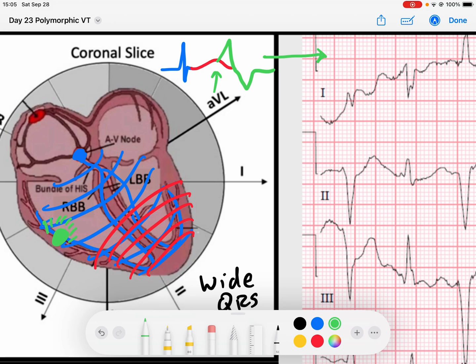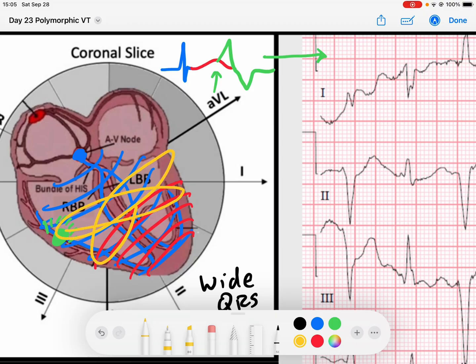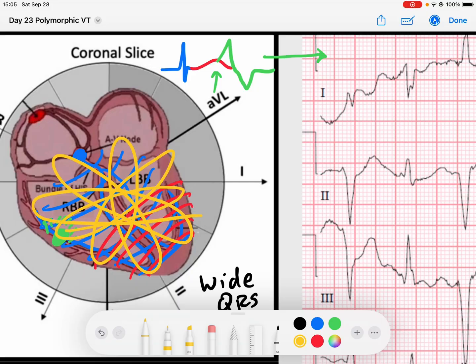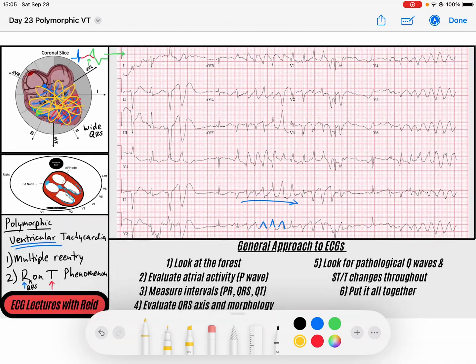Torsades — it looks like it's twisting, because the reentry mechanism can almost twist about itself. You'll see it reenter, then reenter again in a different morphology, and every single time it reenters it creates a different QRS morphology. And those are the two mechanisms of polymorphic ventricular tachycardia: multiple reentry pathways, and the R on T phenomenon.